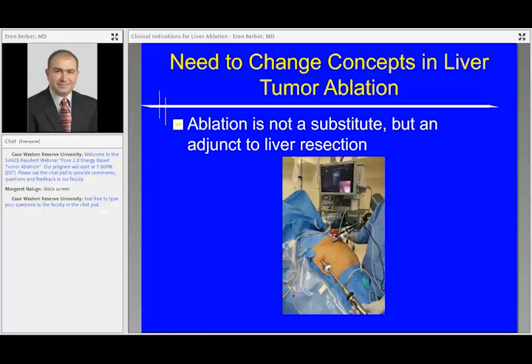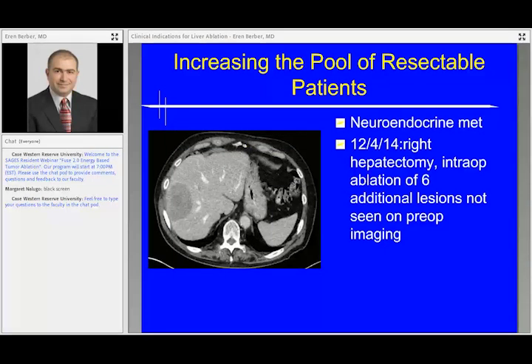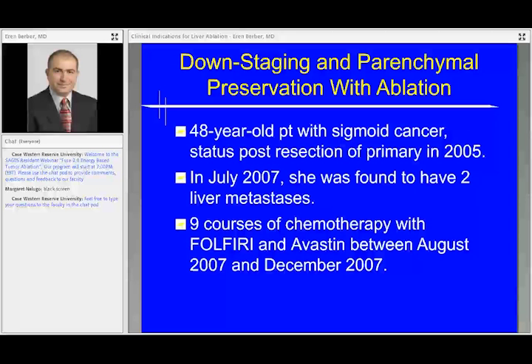Overall, I think that we need to change the concepts in liver tumor ablation. Ablation is not a substitute, but an adjunct to liver resection, just to give some examples. This patient had a large neuroendocrine metastasis on the right lobe of the liver, and no other lesions on preoperative imaging. But intraoperatively, I identified 6 additional lesions that were not seen on preoperative imaging. So I did a right hepatectomy and also ablated 6 lesions. So I was able to treat the lesions in this patient.